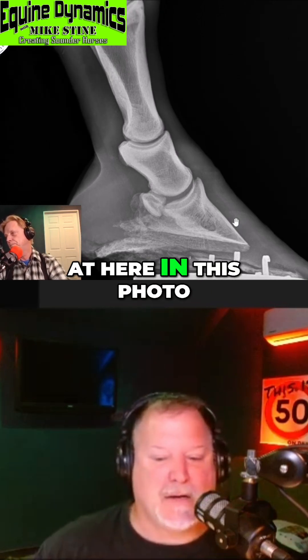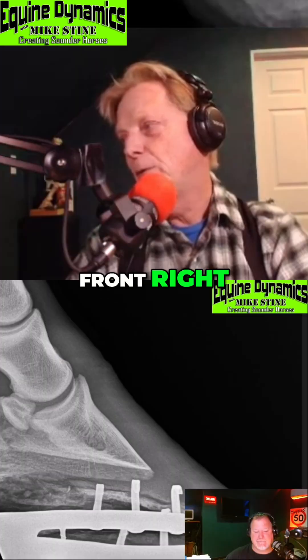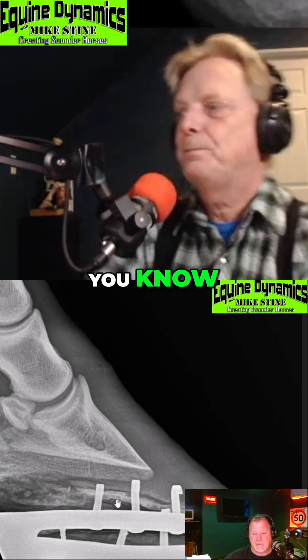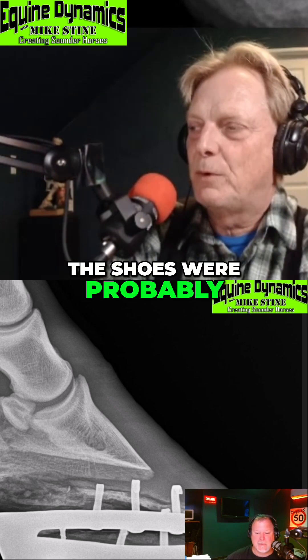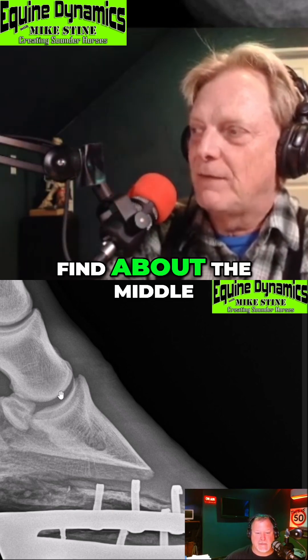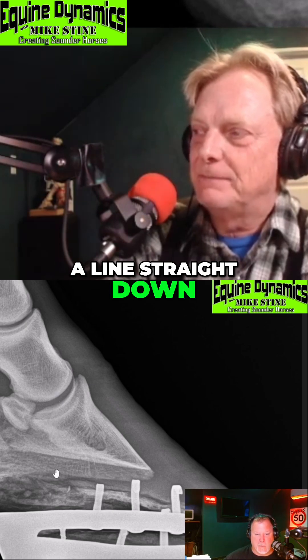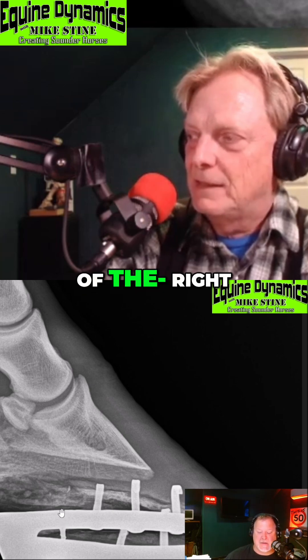So this X-ray right here — what are we looking at? That is a front right foot. The feet are long, the shoes were probably too small when they were put on. They're fit out to the toe. If you drop a line from that joint down, find about the middle of the joint, and drop a line straight down, look where your base of support is — way out in front of the foot. You've got about 80% of the shoe in front of this line and 20% in the back.